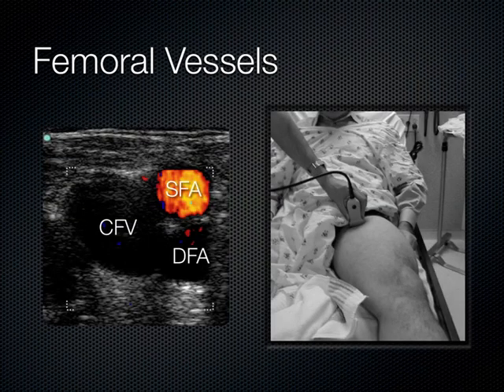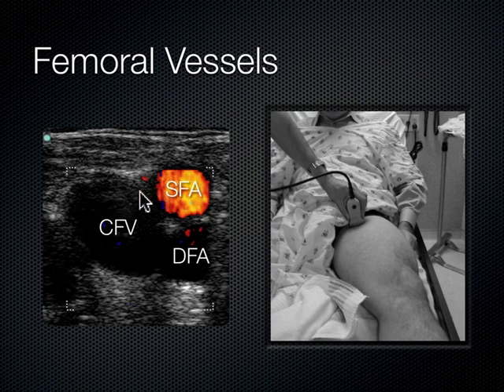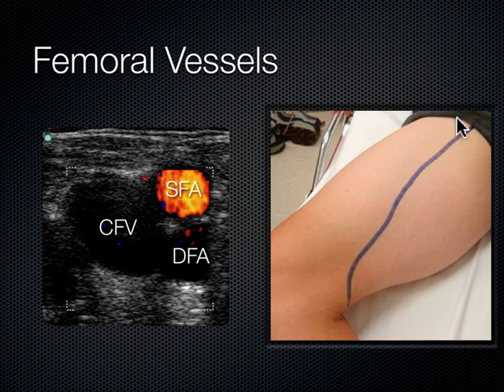Eventually it gets down to the popliteal fossa. Up in the groin area we see the superficial femoral artery and the deep femoral artery with its paired common femoral vein — you can see how they're linked side by side, lateral to medial. How do you remember that the vein is more medial to the artery? Venous rhymes with penis. So whenever I'm teaching at the bedside I have to decide whether to say venous penis or venous vagina. Which leg is this? If the indicator is to the patient's right, it's the left leg — correct, it's the left leg.